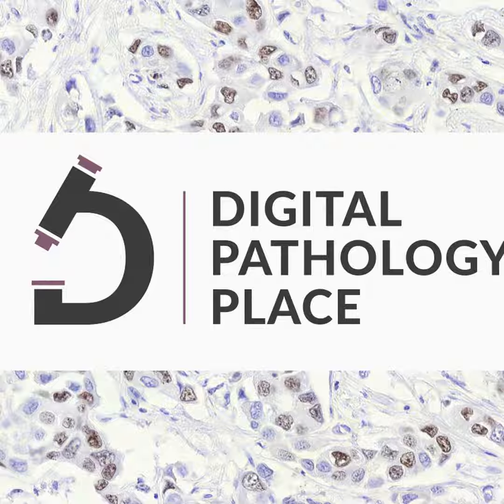In this case, I will say that remember our endpoint was DR minus MR, so the difference in accuracy. Well, in several of the other digital pathology whole slide imaging system studies, a separate primary endpoint was the digital modality accuracy by itself. And for reasons that are historical, we did not declare that as an endpoint in our study. Our study kind of took off during the pandemic, and it was very difficult to get feedback during that time, so we had to take some risk going forward. So that endpoint was not declared prospectively, but of course it was measured.